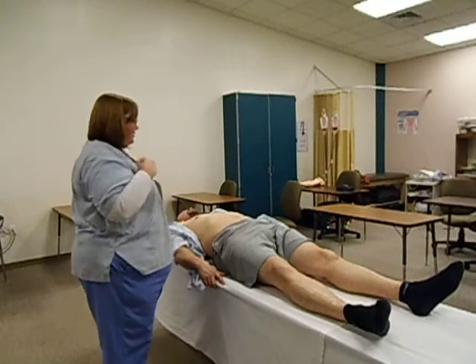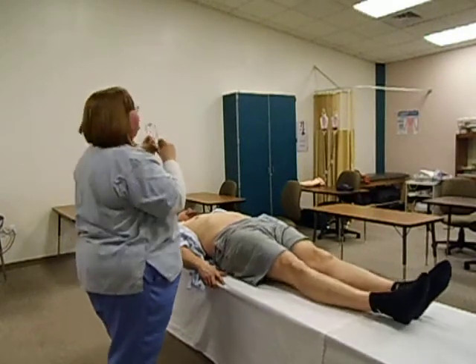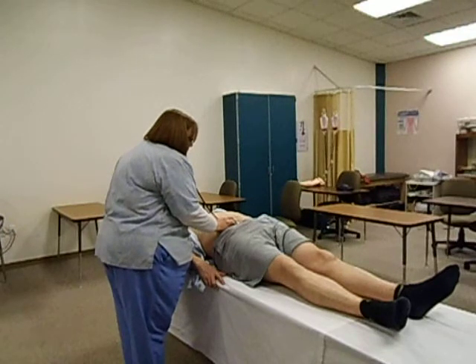We are now going to auscultate bowel sounds in all four quadrants. We would listen for up to 5 minutes, however, for taping purposes, we will not be doing that.